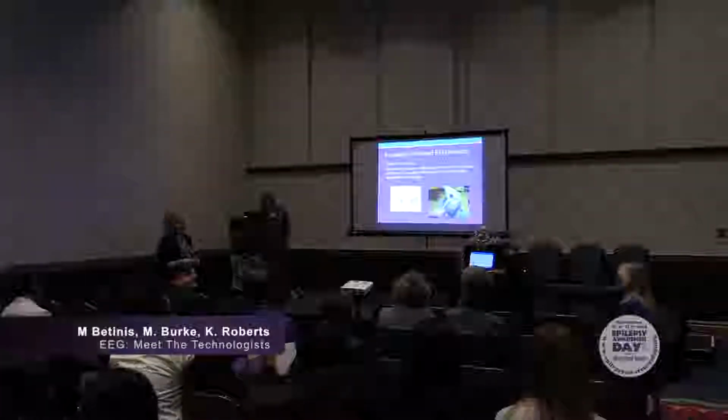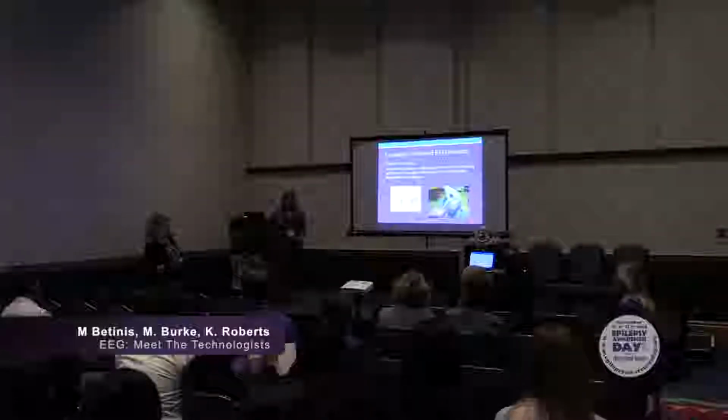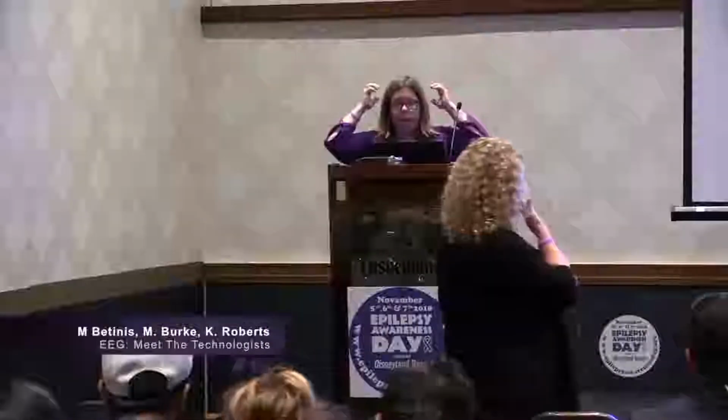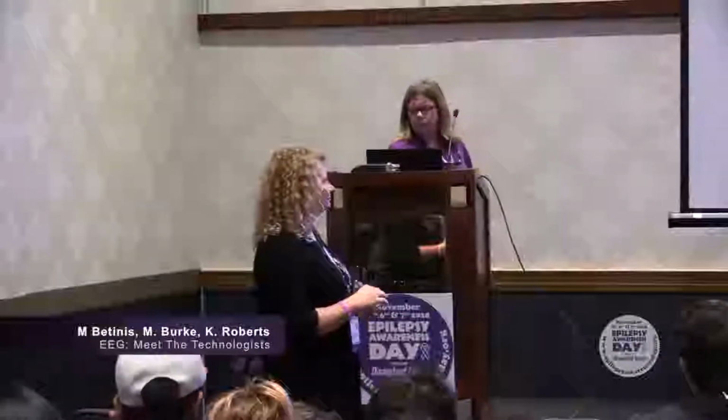And I'm old school. I've been in the field for 35 years. That's like basic fundamentals. That's one of them. Yeah, and that's why sometimes I get this question for the facilities that use caps. Some of you may be familiar with a cap that gets put on or a net that gets put on. Some techs will still measure and put those on, and that's why they're doing that, to ensure that when it lands on your head, they're recording from an exact, precise spot.